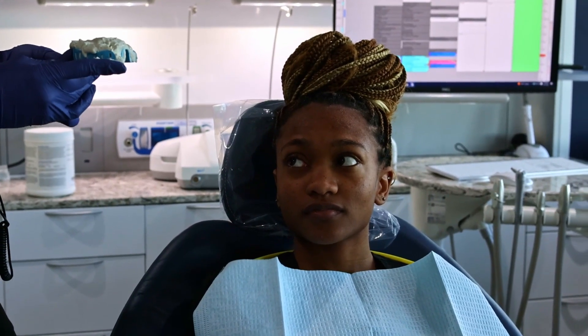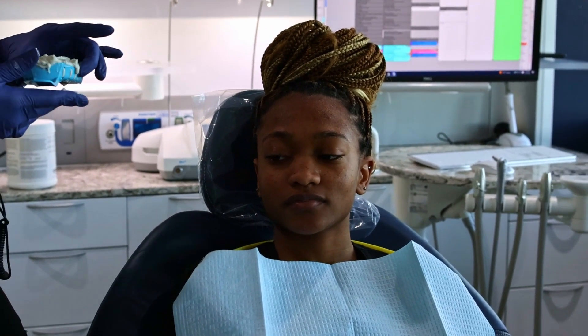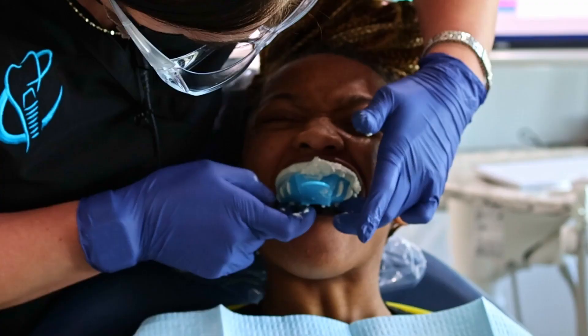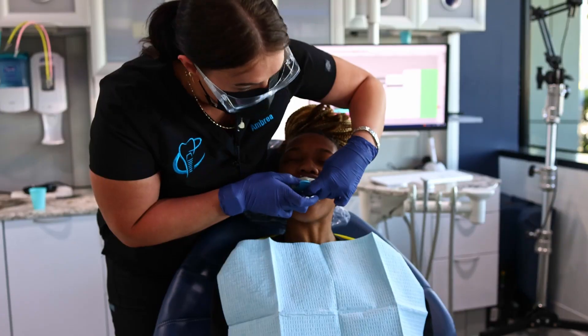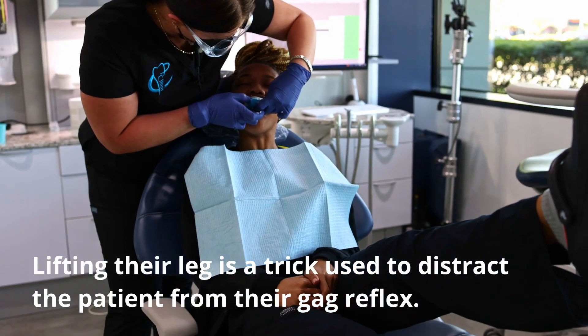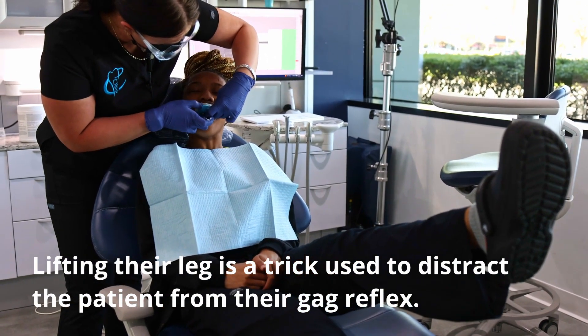It is going to run down the back of your throat a little bit. I want you to just try to take a nice deep breath through your nose. Take a nice deep breath, stay open. Now I need you to flip your lip down like you're... Good, perfect. Go ahead and lift one leg and just hold it there. Breathe, nice deep breath through your nose. Tilt your chin down towards your chest a little bit.